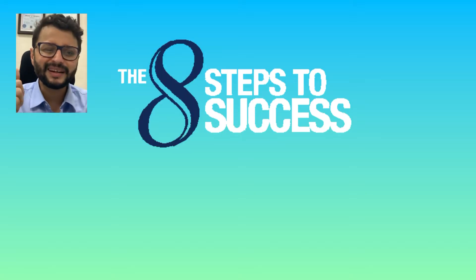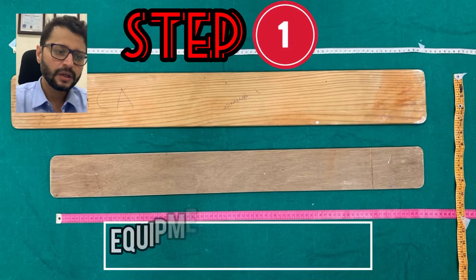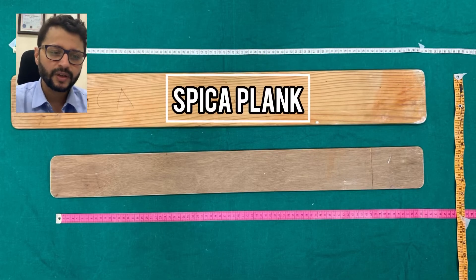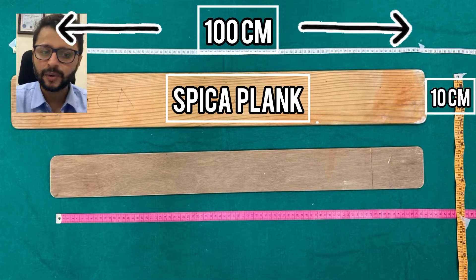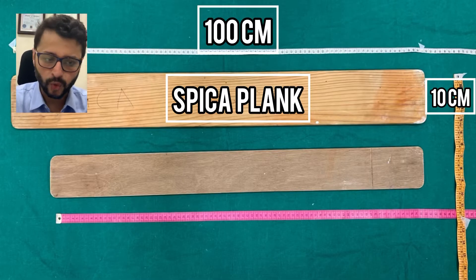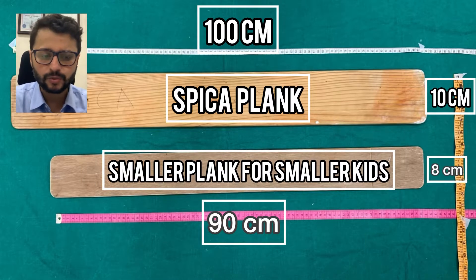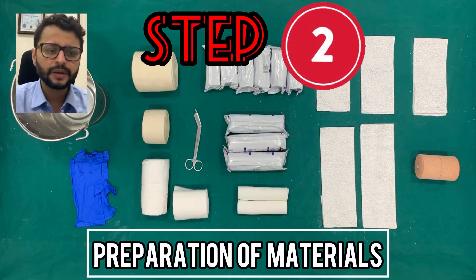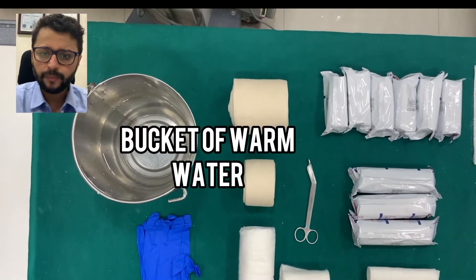What are the eight steps of success for hip spica application? The first is equipment preparation. I use something very low-tech — just a spica plank. This plank is about 100 centimeters in length, 10 centimeters in width, and about a centimeter thick, made of wood. I make a smaller plank for smaller kids which is 90 centimeters by 8 centimeters.